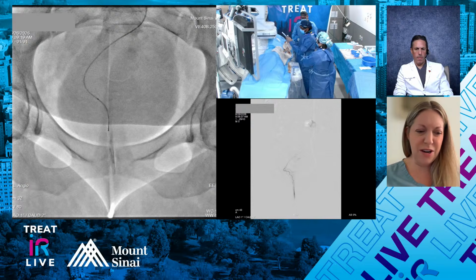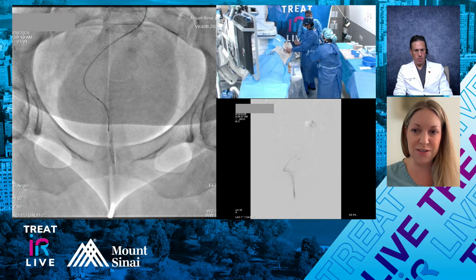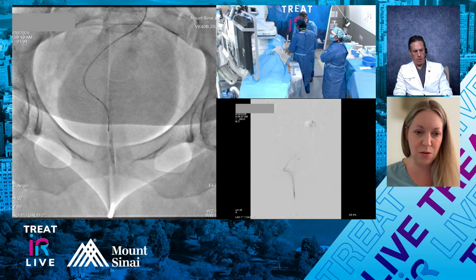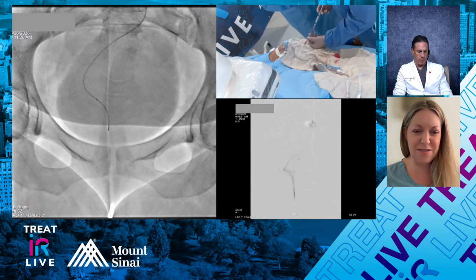No, you don't need to. I know some folks are giving nitro, but this isn't like a prostate where we're trying to force in a lot of particles. So unless there's a spasm, I'm not giving nitro. You also wonder, at least I wonder, when you give nitro in this vascular bed that you're going to open up different branches and different collaterals, like middle rectal, things like that.